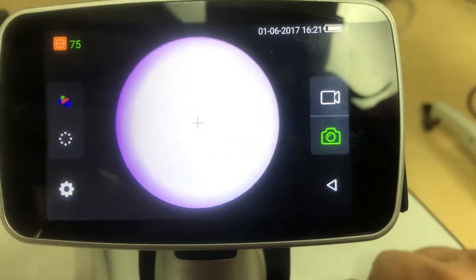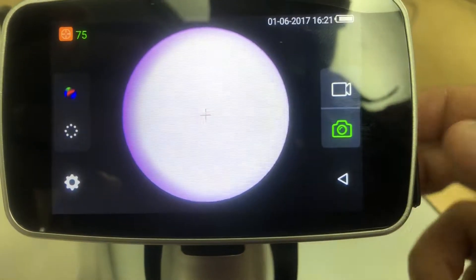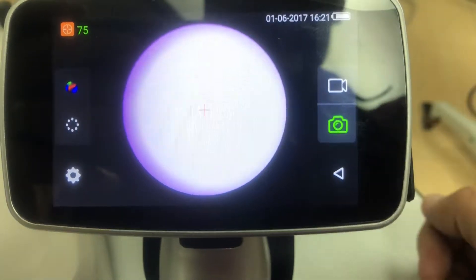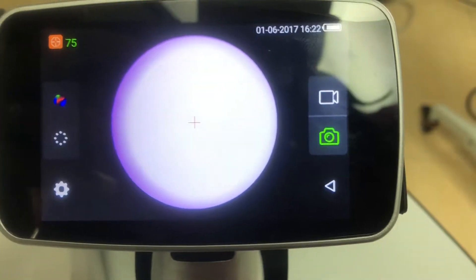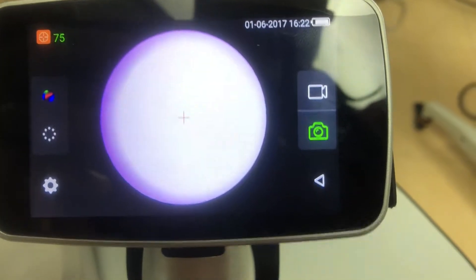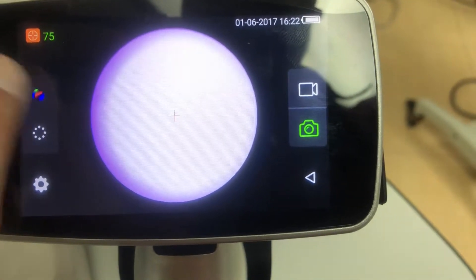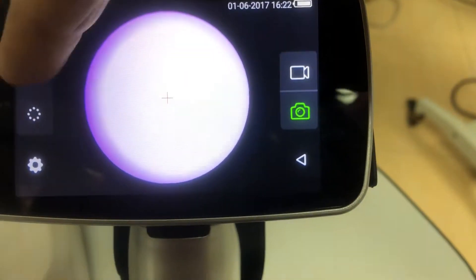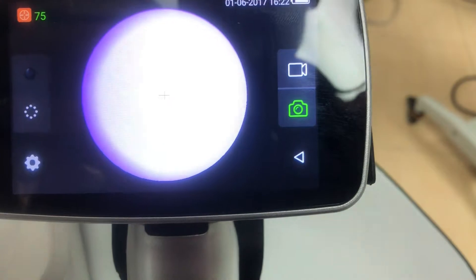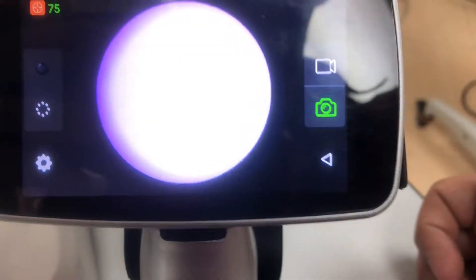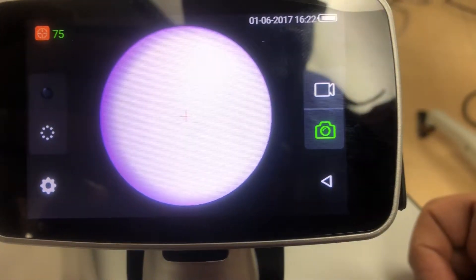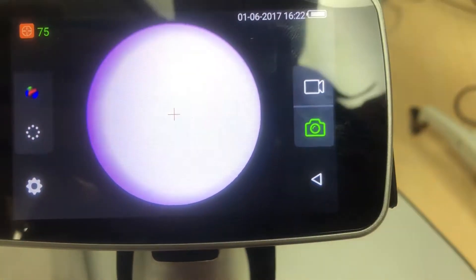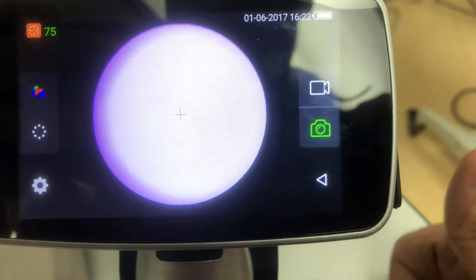Once you click on that, here we have different settings. You can do video, you can do pictures. There's also this option here — this is for color photography. If you want to do black and white, select that button. Now it's on black and white mode. Let's put it back to color.